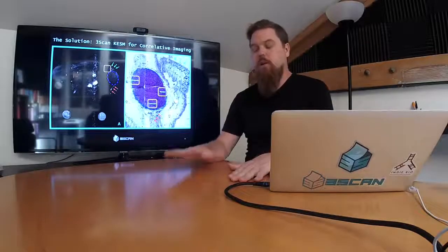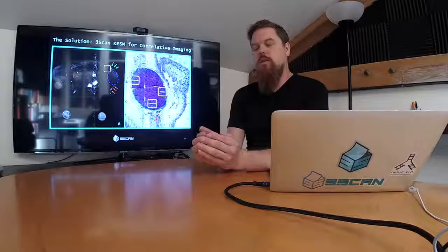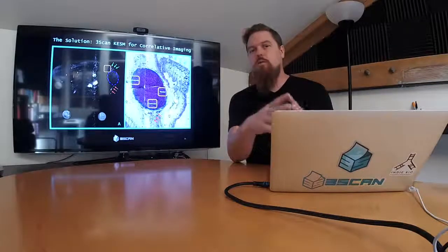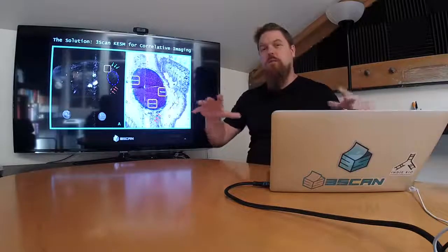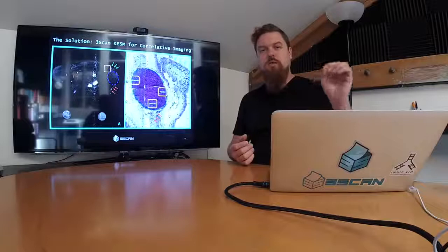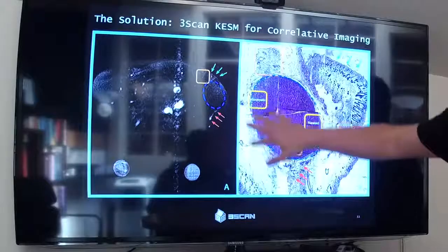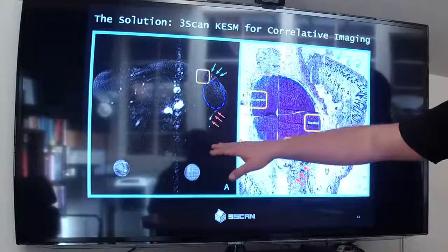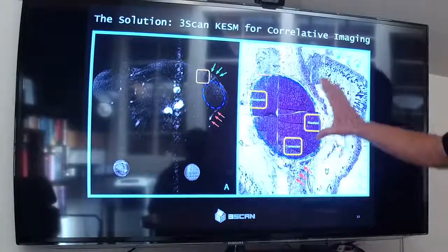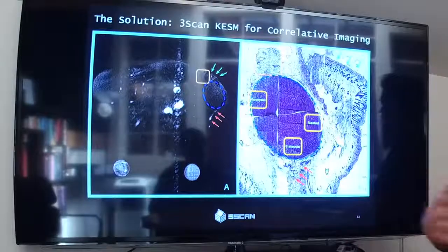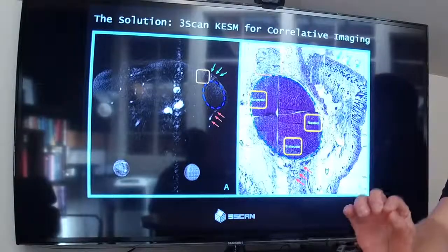And so one example of this is correlative imaging. And in classic pathology, the amount that you look at is so tiny that if you compare it to radiology data of the same tissue, you have no idea where it came from inside that tissue. At 3SCAN, because we can image volumes that are extremely large, we can segment and reconstruct features that you can see in both the radiology and the pathology. And so here's that tumor that I showed you earlier with an MR that was done previously. And so these vessels, we can see in both and then we can use that to align and co-register the two different data sets.